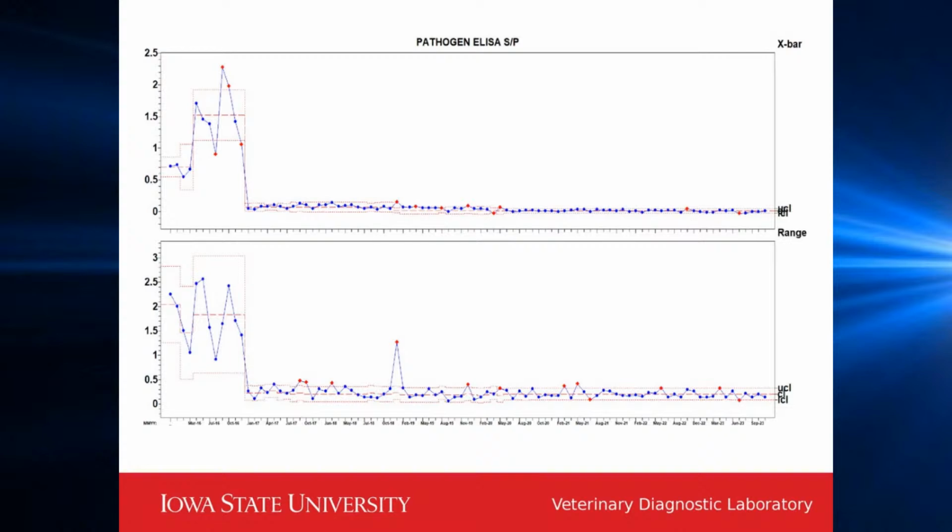And so these are the results, and the interpretation of those data are that the herd had been diagnosed with mycoplasma during these 4 data points and even before that, and decided that they wanted to eliminate the pathogen in order to be able to sell pathogen negative replacements later on. So whatever the pathogen elimination practice was, it appeared to result in an increase in the exposure, which led to an increase in infection of the remaining population of sows that were on this farm.